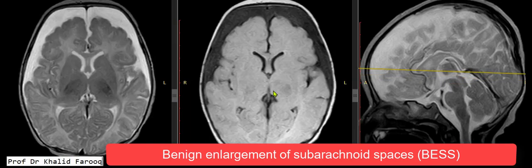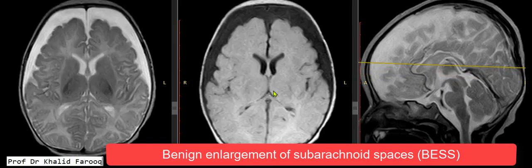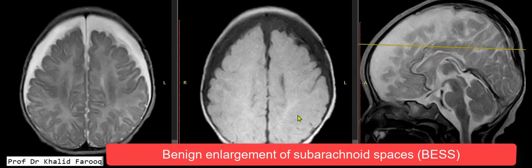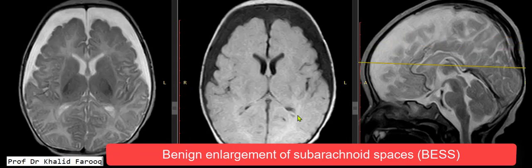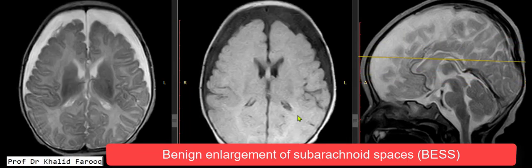This is a typical example of benign enlargement of subarachnoid spaces. Usually infants are referred by the pediatrician for assessment of the etiology of an enlarged head size, and sometimes we see minimal enlargement of ventricle size with prominent extra-axial CSF spaces or subarachnoid spaces. In this case, the ventricle size is normal and there is no gray or white matter abnormality except mild diffuse thinning of the corpus callosum.